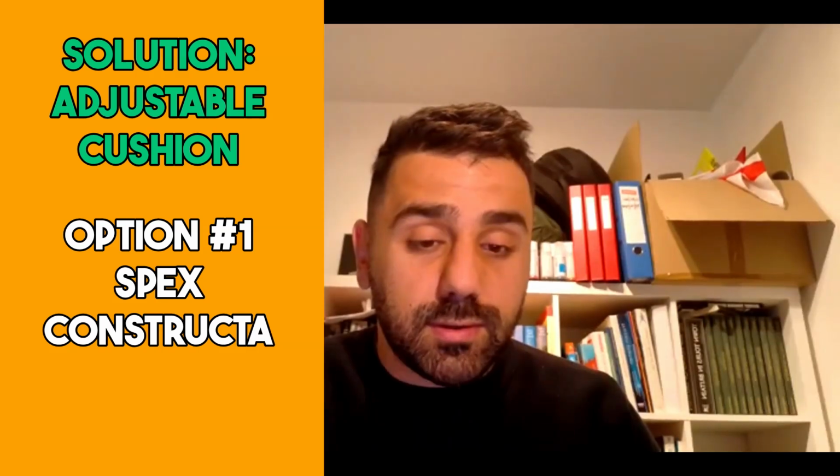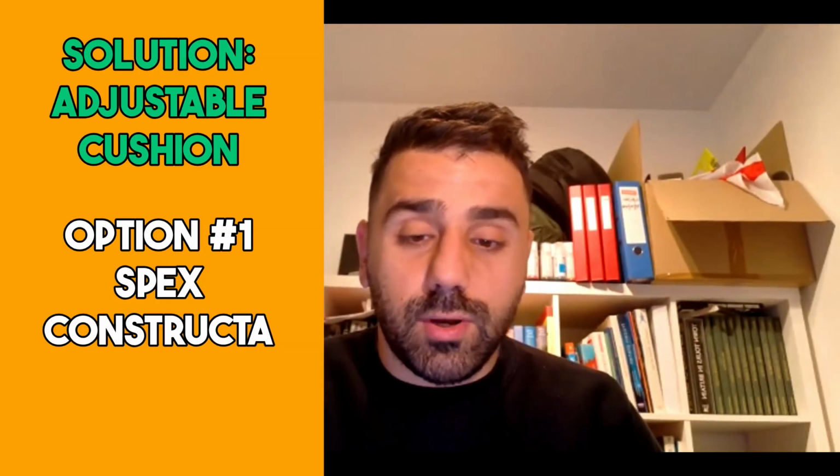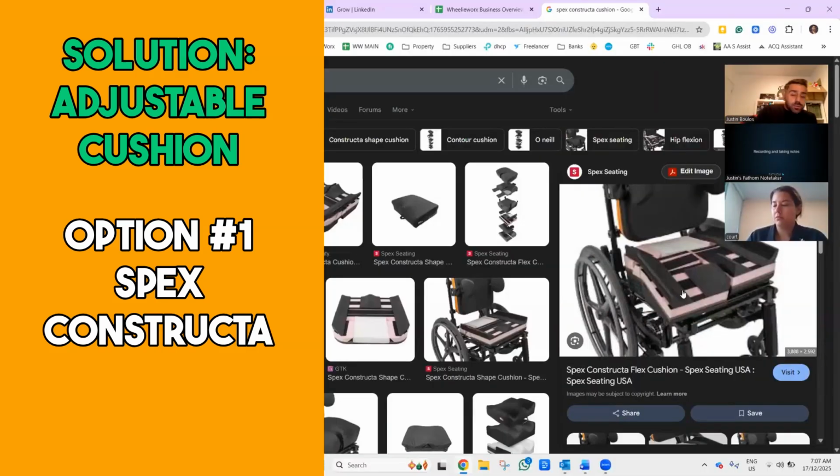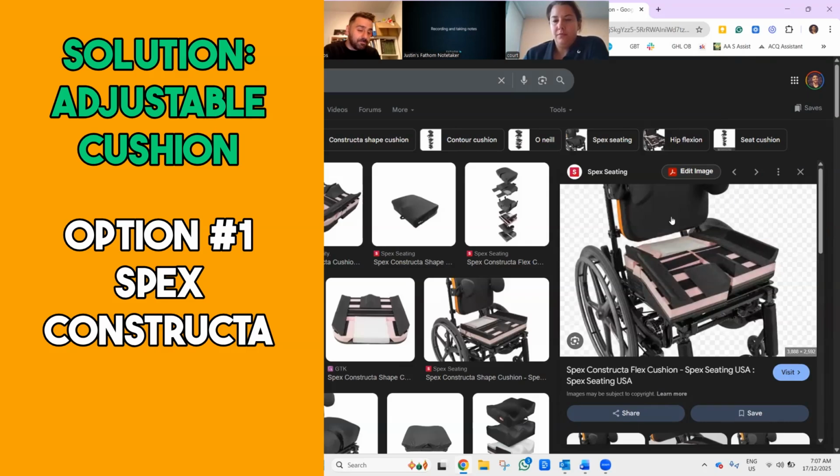I can give you a good example of what it is and why it would be suitable for your particular client. So it's quite a thick cushion. It basically allows you to scoop out some of the foam underneath the side where they don't have that hip flexion. This is actually perfect for this particular client because his left leg can come up to 90, but his right leg needs to come down.